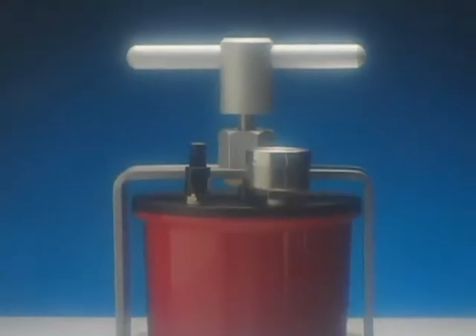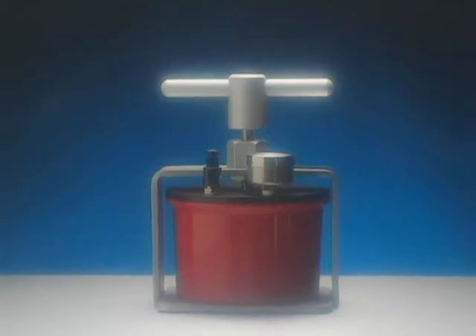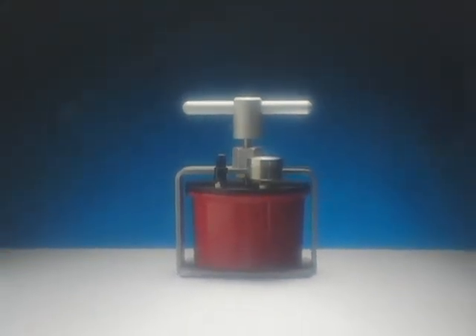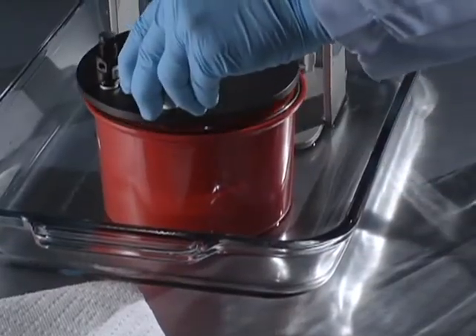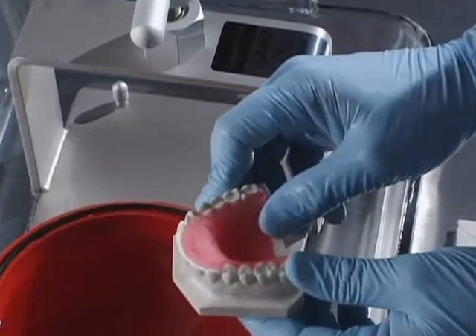Lang Manufacturing offers dentists an outstanding pressure curing unit for dental appliances made with self-curing acrylic, the AquaPress. This video will show you how simple it is to use and how attractive it makes your dentures and other appliances.